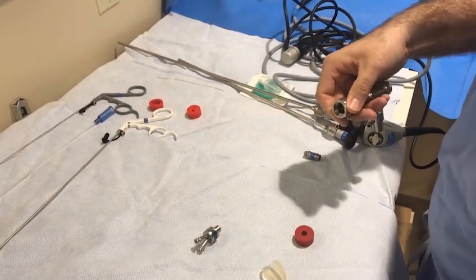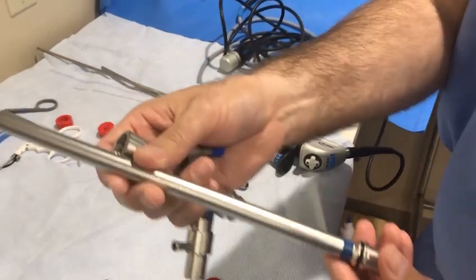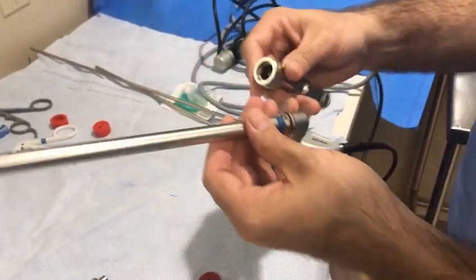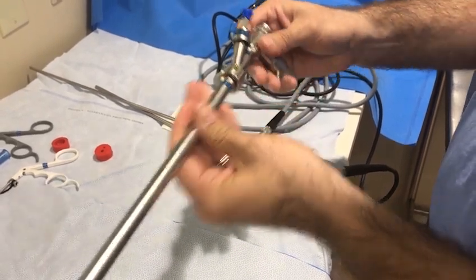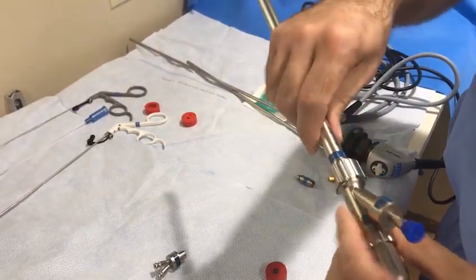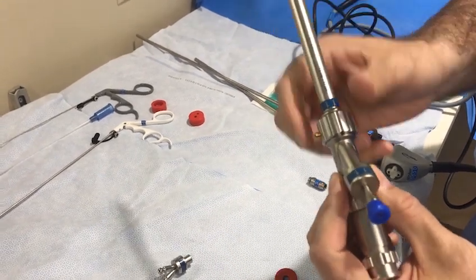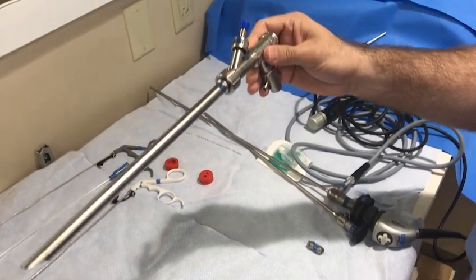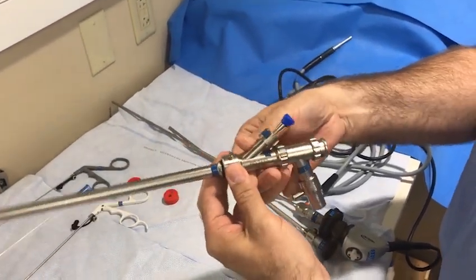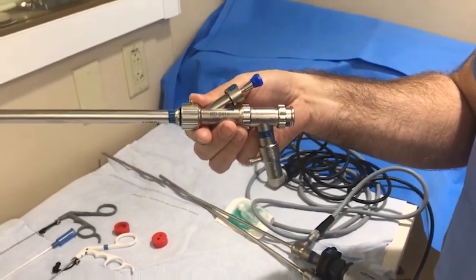The next steps involve the assembly of the tracheoscope. Select the desired size tracheoscope; in this example, the 11-12 millimeter or black tracheoscope is chosen. Align the black dots on the distal end of the instrumentation barrel with the black dot on the proximal end of the tracheoscope. Click the scope into place and rotate the locking mechanism. As with the bronchoscope assembly, ensure that the connection is secure.